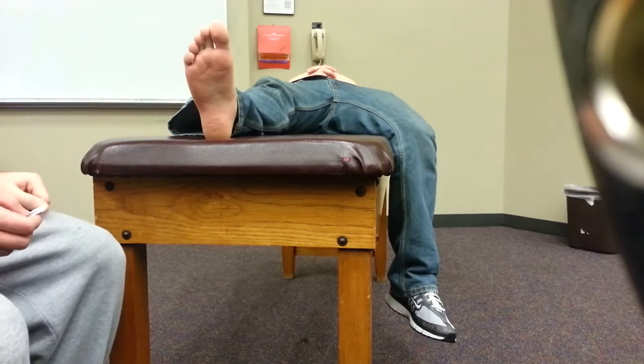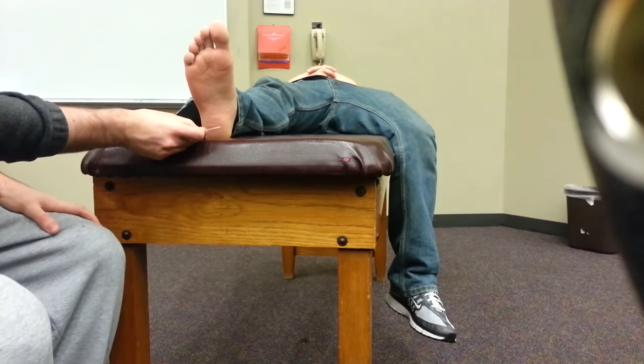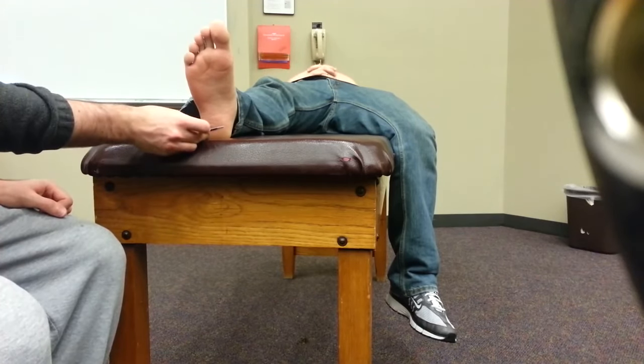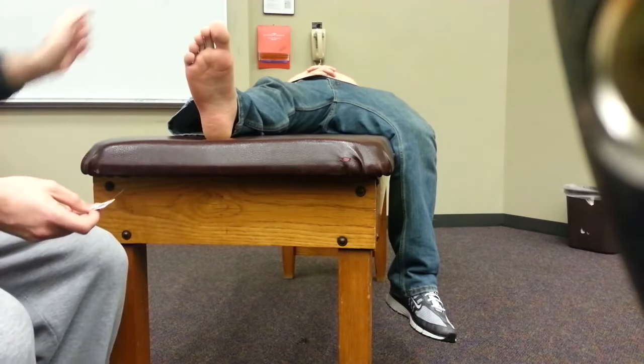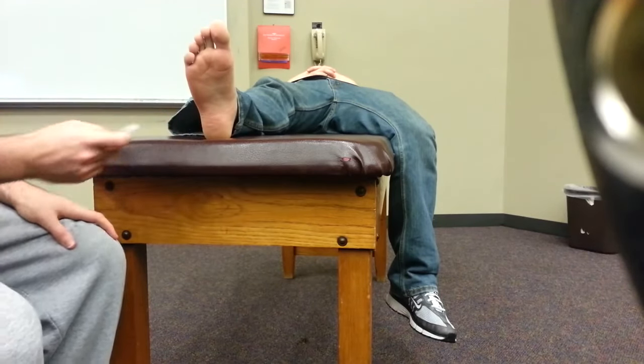Let's assess the plantar side of his foot first. I want to be placing the monofilament against the patient's foot just enough so it bends the monofilament — I don't want to apply too much pressure. One note is that the patient is laying down and they cannot see you place the monofilament on their foot.